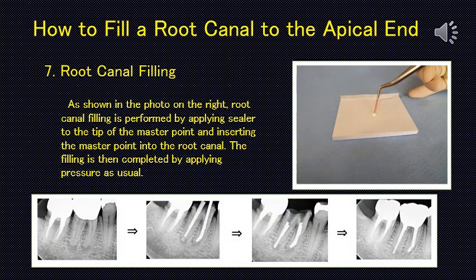7. Root canal filling. As shown in the photo on the right, root canal filling is performed by applying sealer to the tip of the master point and inserting the master point into the root canal. The filling is then completed by applying pressure as usual.